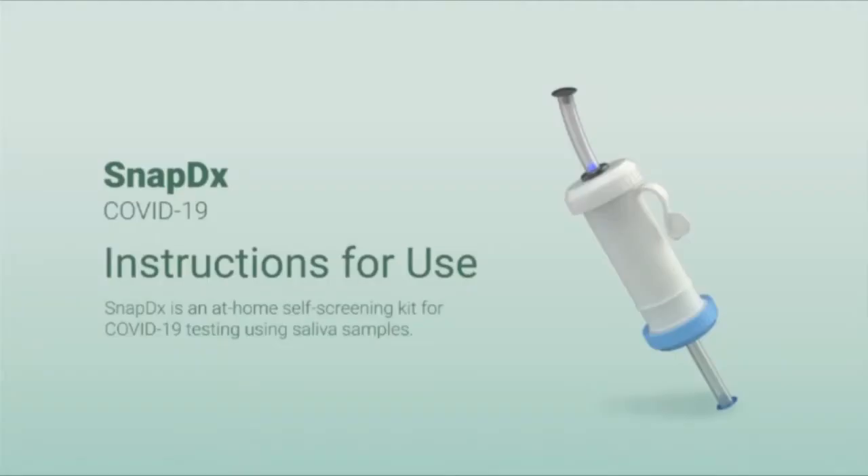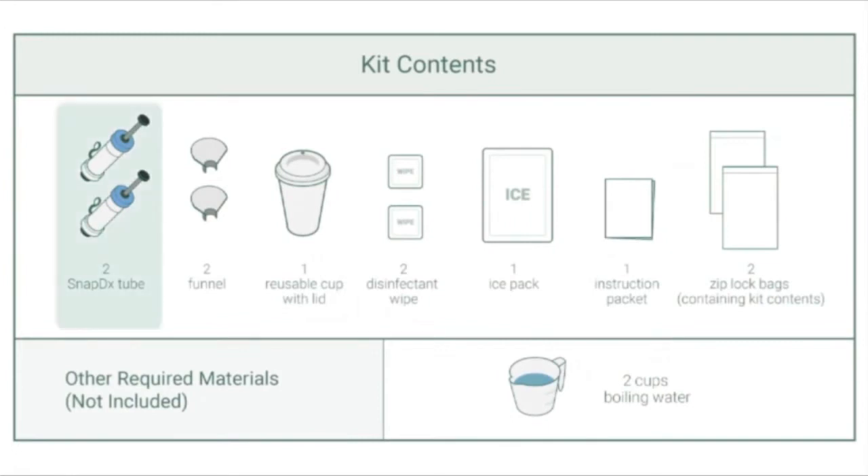Hello, and welcome to the SnapDx at-home self-screening kit for COVID-19 instructions for use videos. In this kit, you will find two SnapDx tubes, two funnels, one reusable cup with lid, two disinfectant wipes, one ice pack, one instruction packet, and two Ziploc bags which hold kit contents. You will also need two cups of boiling water. The cup with lid, ice pack, and instruction packet are meant to be used for both tests. All other components are single-use only.